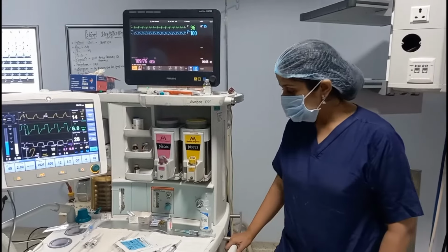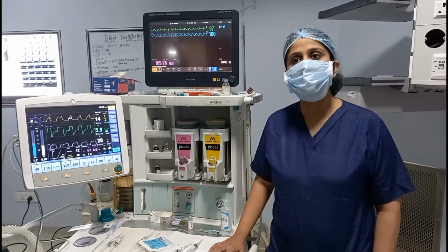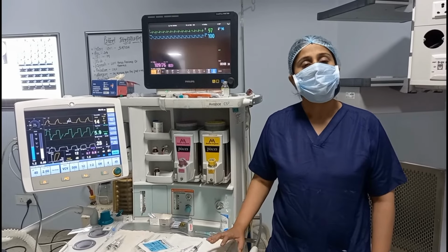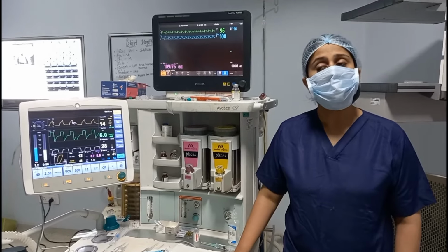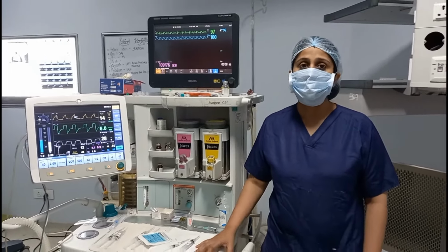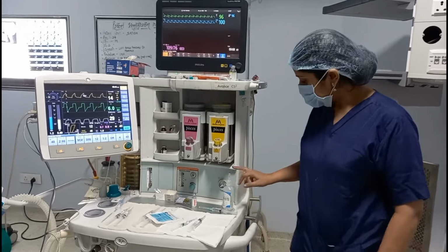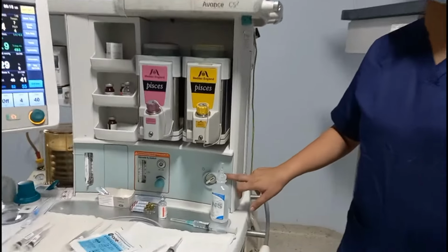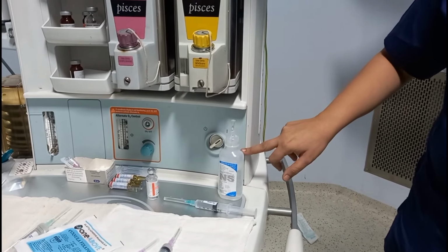Now, continuing with our Boyle's apparatus, as we were discussing, I want to show you the modern anesthesia machine. This modern anesthesia machine has been modified electrically, pneumatically and mechanically from the Boyle's apparatus. First of all, we will discuss the electrical modifications, starting with the master switch. This master switch is an electrical switch which can turn the machine on and off.